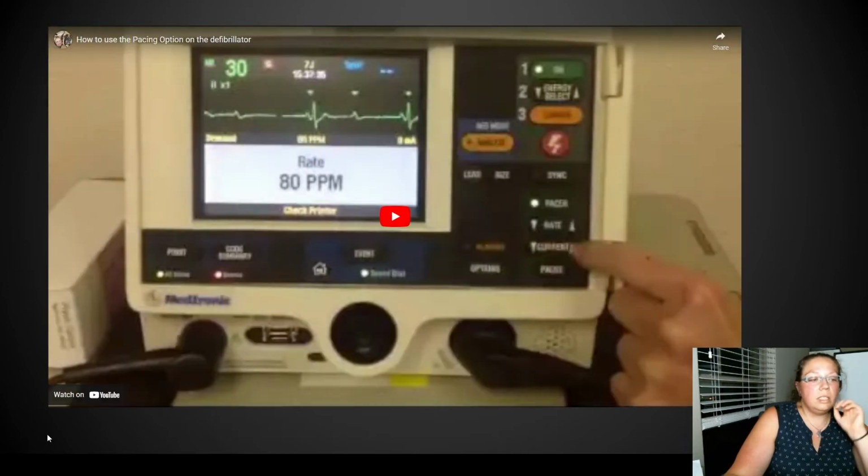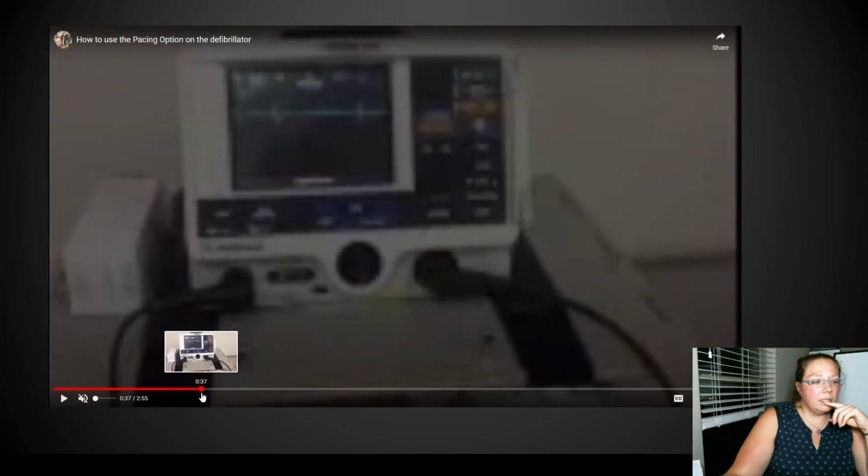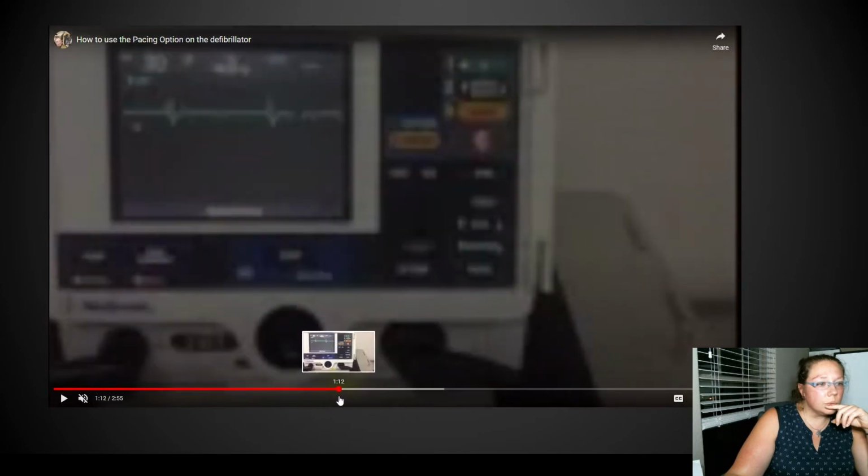So I'm going to show you part of this video. This is actually the defibrillator. It looks very similar to what we use. It's actually, I think, the same one. But I'm gonna play part of this video with the sound off. And I'm gonna show you how capturing works.